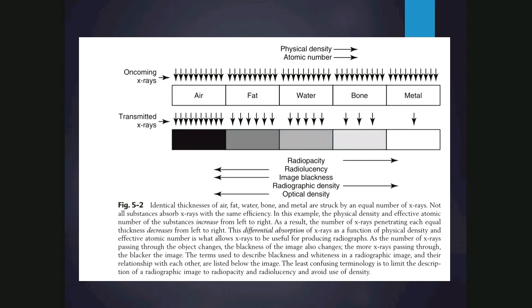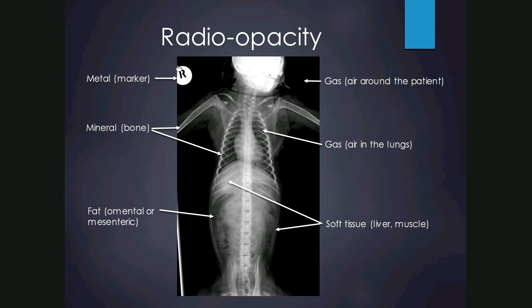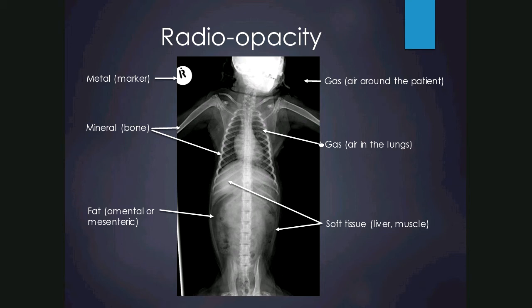Here's an example radiograph of a monkey showing the different opacities. The metal marker is very bright white. Bone is slightly less radiopaque but still quite white. Soft tissues such as the liver or muscles are intermediate. Even more radiolucent is fat — mesenteric fat for example — and the most radiolucent is gas, seen in the lung or around the patient. Gas around the patient looks darker than that in the lung because the lung still contains small soft tissue structures such as vessels and bronchi.